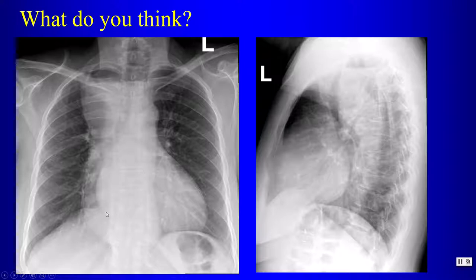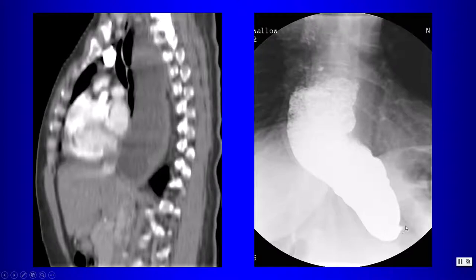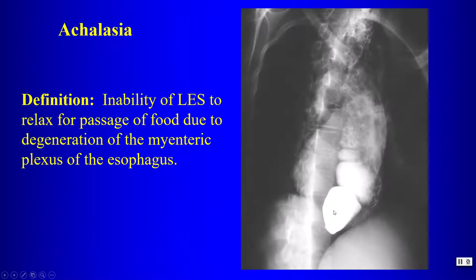Next case: a large mass extending below the diaphragm with mass effect on the trachea and, importantly, an air-fluid level on both frontal and lateral views. This represents a dilated esophagus full of debris — an example of achalasia. With achalasia the esophagus is dilated down to the gastroesophageal junction, as shown on CT and sagittal reformats. The cause is inability of the lower esophageal sphincter to relax for passage of food.